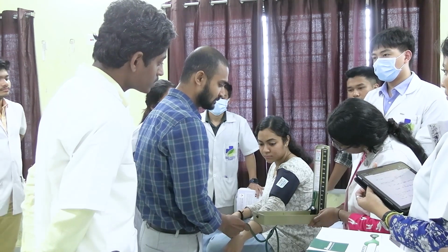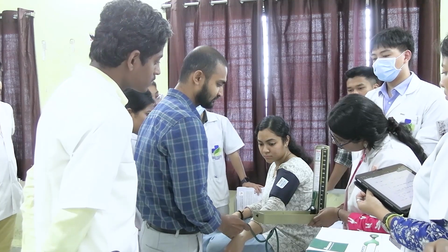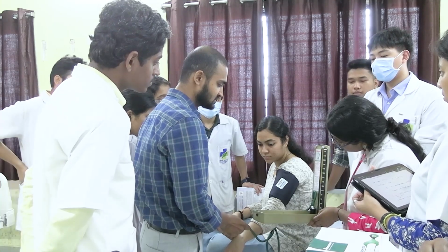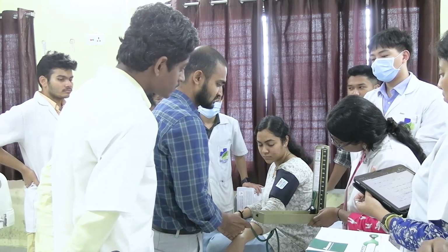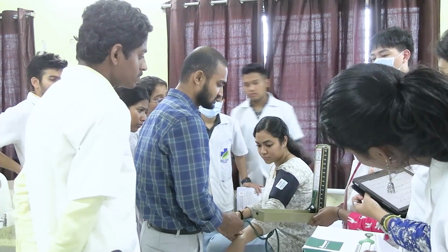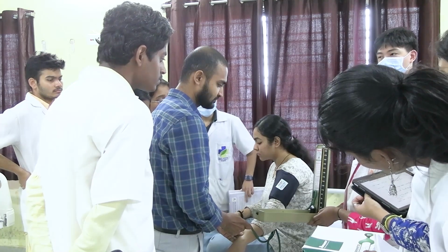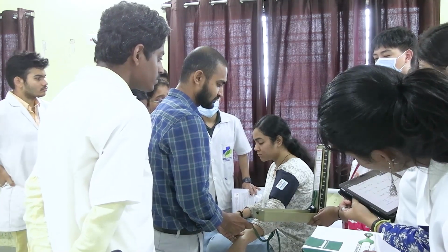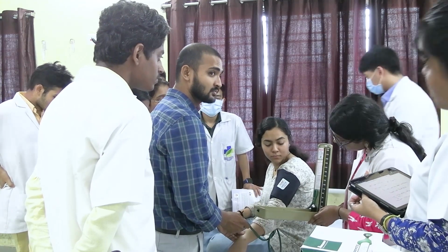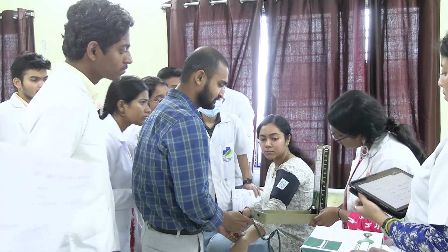This needs practice. See, it is going so fast. It should be very slow, na? Per second you should drop the mercury level only a little.